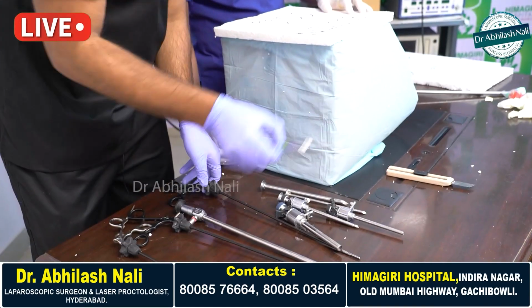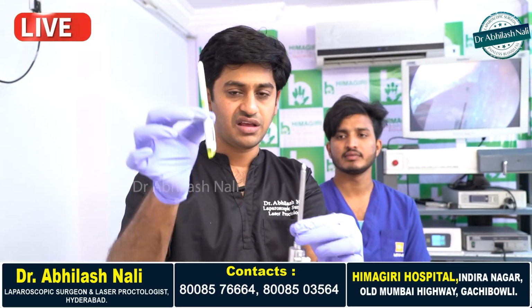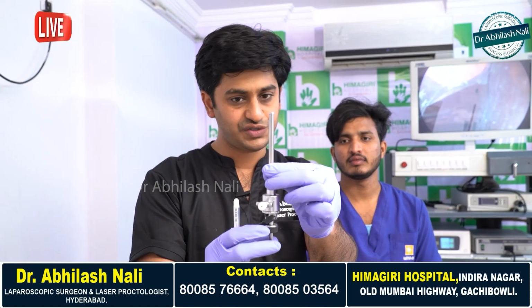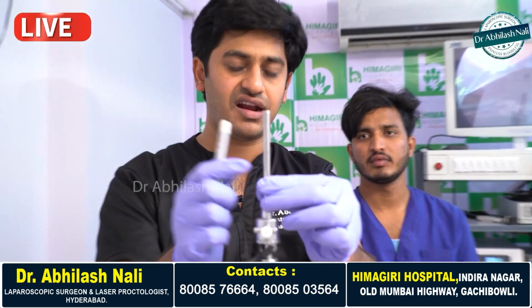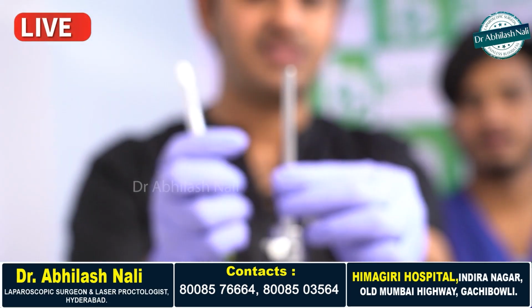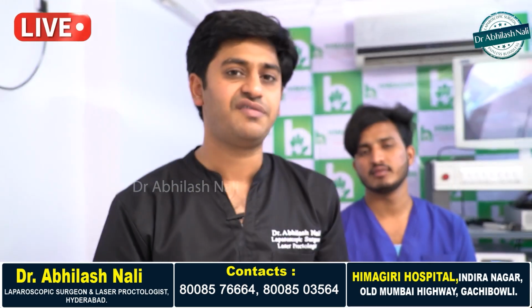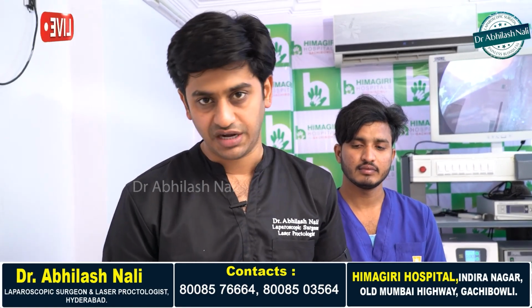And how large will these instruments be? If you look at a side-by-side comparison, this is the normally used pen, and this is one of the laparoscopic instruments which we generally use. If you look at the diameter of the pen and the diameter of the laparoscopic instruments, this is much thinner than the normally used pen, and the incision you will be left with after a laparoscopic surgery may vary from 0.5 to 1 centimeter only.